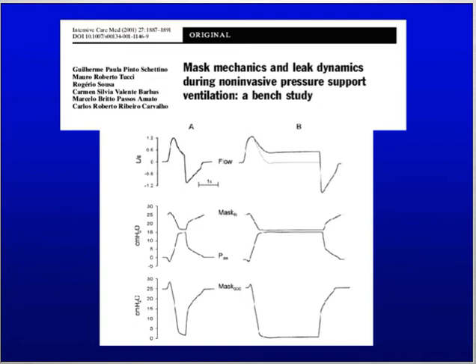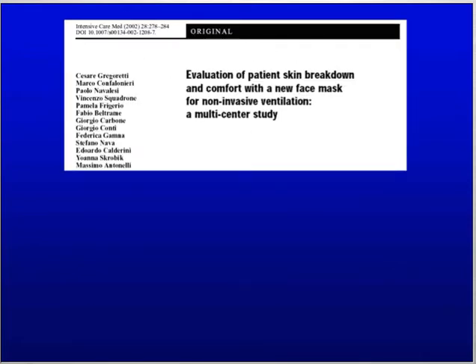But when the pressure in the ventilator became higher than the pressure within the cuff, then the delta pressure crossed the zero line, and there were leaks and this usual asynchrony, which is a prolonged inspiration because the ventilator becomes unable to detect the end of inspiration. So this is a key issue in the specific aspect of non-invasive ventilation.